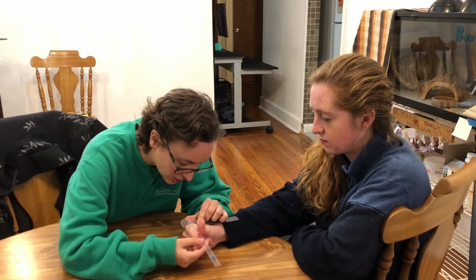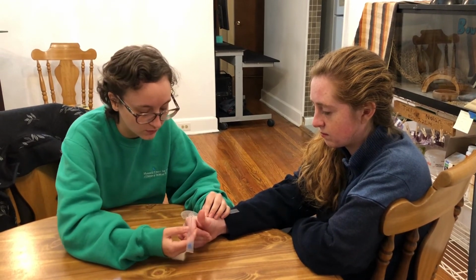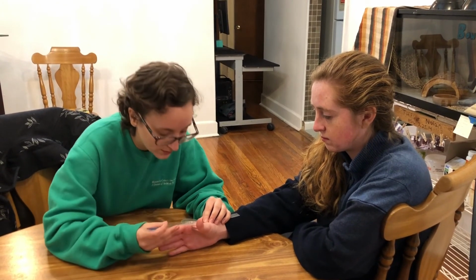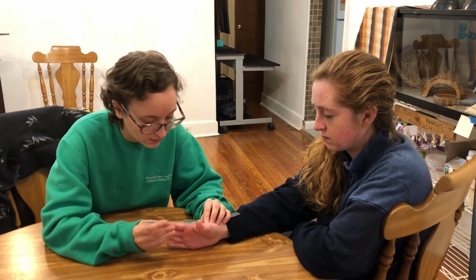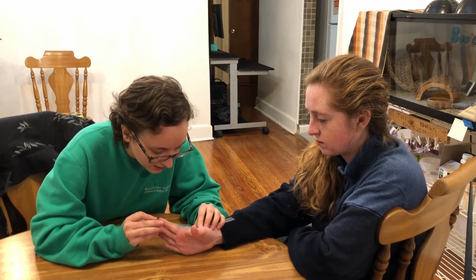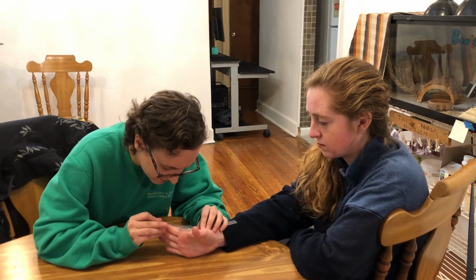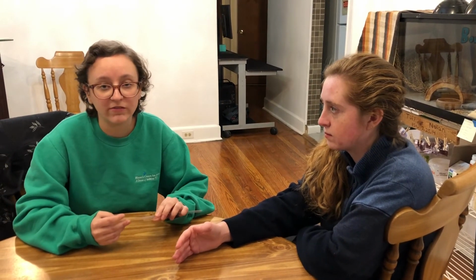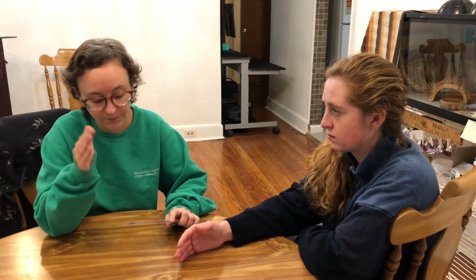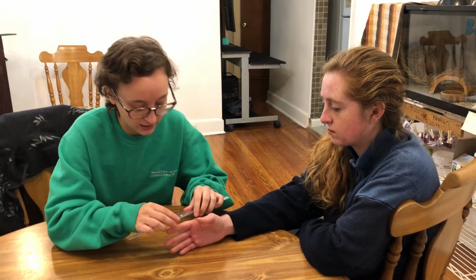Okay, and she's getting to 90 degrees for MCP flexion, which is good, that's normal. And then we're gonna go back to this neutral position here, and for this one, what I want you to do is extend your fingers backward. Okay, great, and again, I'm just following this first finger, and we're getting to 50 degrees, which is good. Normal is 0 to 45 for MCP extension.